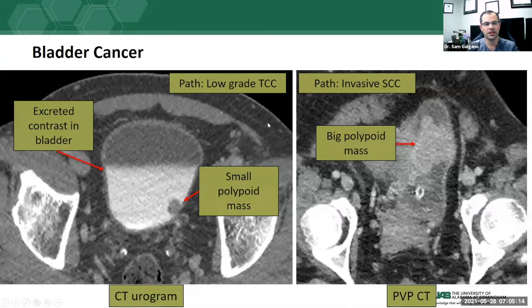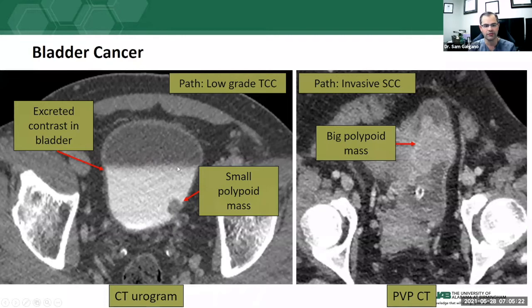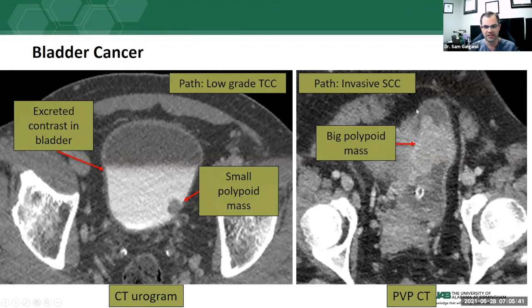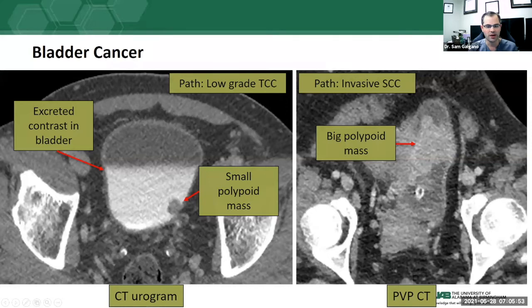Bladder cancer is the most common concern. On a CT urogram, we can see a small polypoid mass protruding into the urinary bladder as a filling defect — in this case a low-grade transitional cell or urothelial cell carcinoma. On a standard portal venous phase CT, even without contrast in the bladder, a large enhancing frond-like polypoid mass extending into the bladder lumen may be visible — in this case invasive squamous cell carcinoma, which is somewhat unusual in bladder cancers.